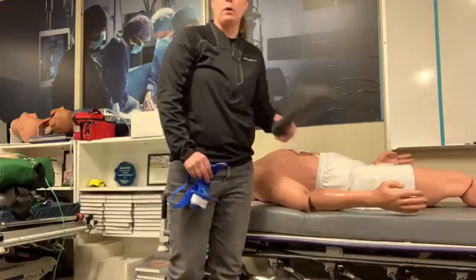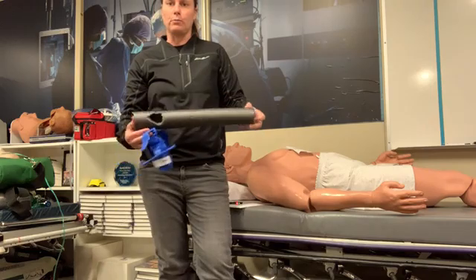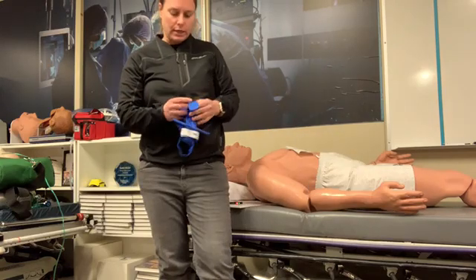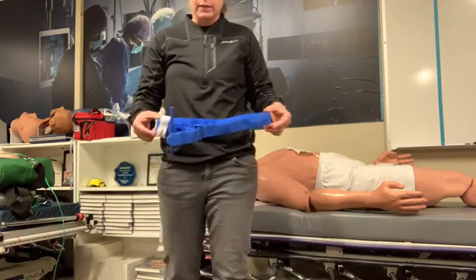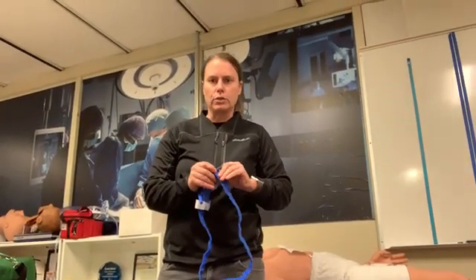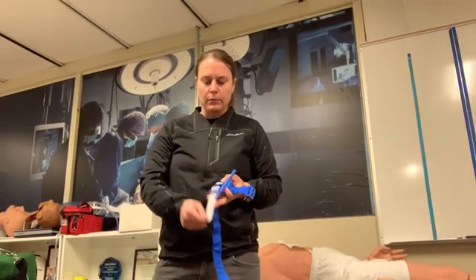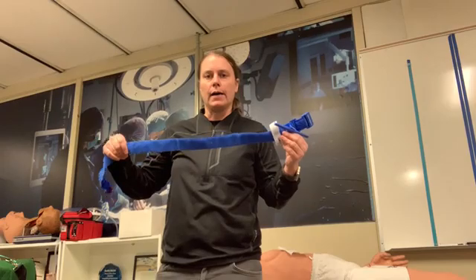If it's a human, we'll likely give you a pool noodle. It'll be sitting beside the patient, and the judge will prompt you to put this on rather than putting this on our live patient over and over again. I'm going to put this on myself as a live patient so you can see a little bit about how these work and give you a little bit of a tutorial. So I'm breaking a little bit from the rubric here because I want to make sure you guys have the training on how to use a piece of equipment like this. And so the rule that the American Heart Association gives you with this and Stop the Bleed is to use it 2 inches above the wound.